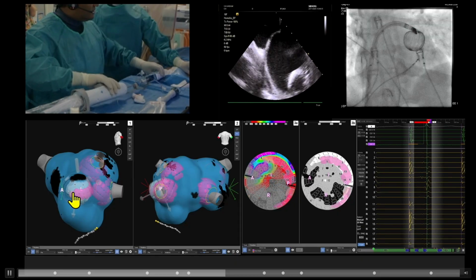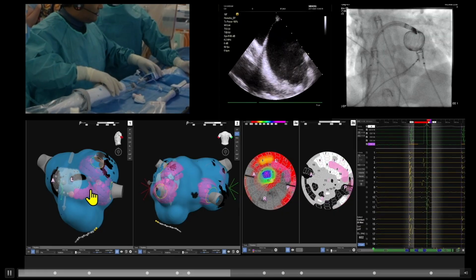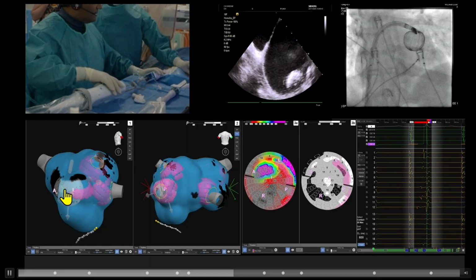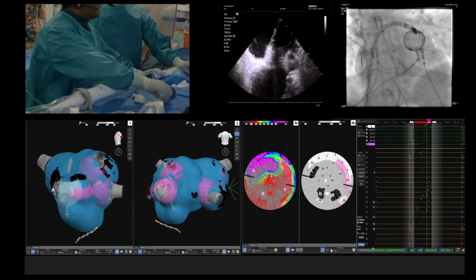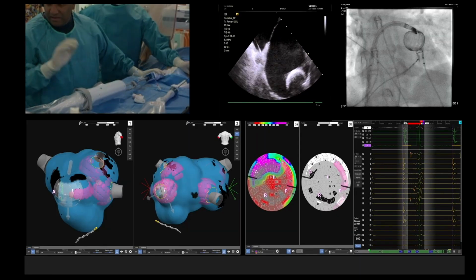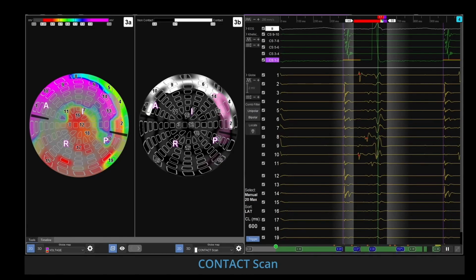Then we want to go a little bit more laterally. So here we're going to counterclock the device a little bit and position it closer toward the annulus. So we got this region and this region. And again, I think contact here is critical. I think the most important issue in my mind for lateral mitral isthmus ablation is stability and contact. I think that's the issue. It's not tissue thickness. Do you give nitroglycerin in this area? Yeah, we typically, for these, unless you're doing RF.